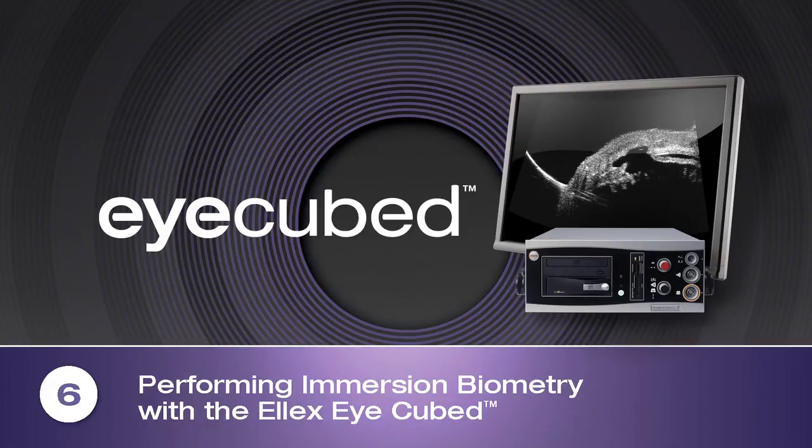Performing immersion biometry with the Ellex Eye Cubed. Performing immersion biometry with the Ellex Eye Cubed is easy, fast and accurate.